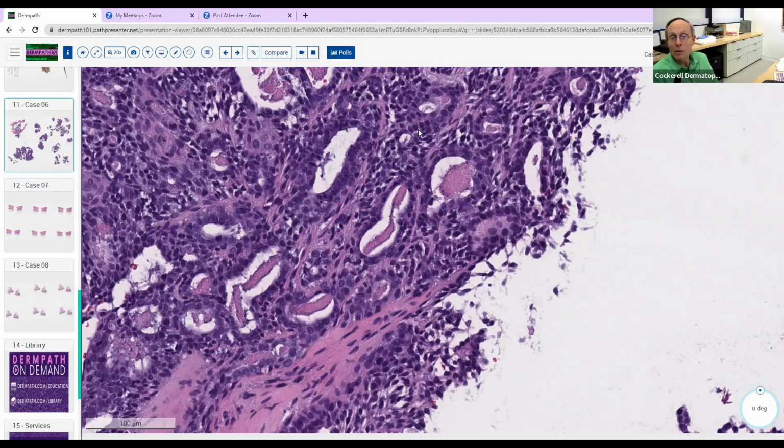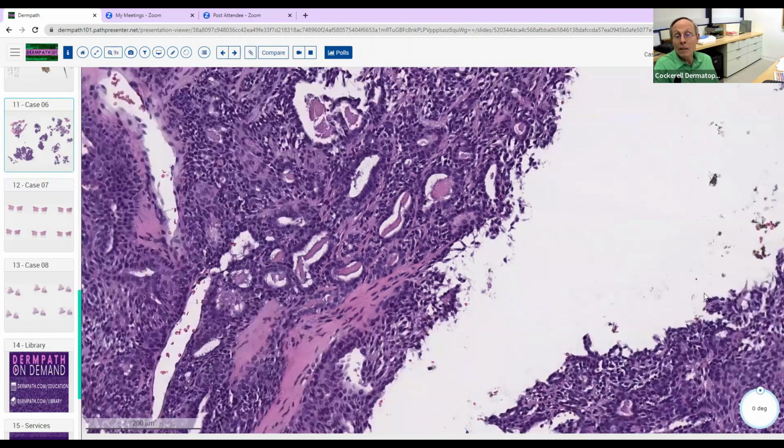Good, excellent. That's exactly right. So you don't necessarily have to have a lot of pleomorphism, a lot of mitoses, a lot of striking atypicality for certain lesions to be malignant. If you look at a dermatofibrosarcoma protuberans, for example, you may not see one single mitotic figure or atypical cells, and it's a locally aggressive lesion that can degenerate into a fibrosarcoma. So that's a malignant lesion that doesn't have to have a lot of atypia.